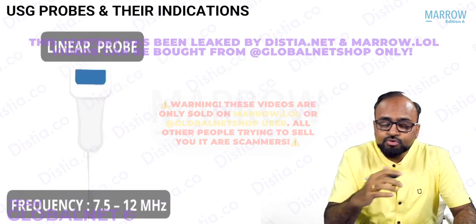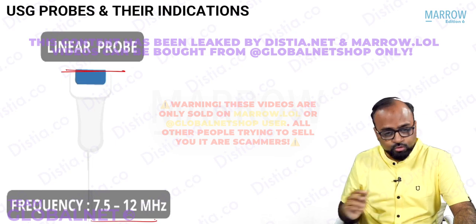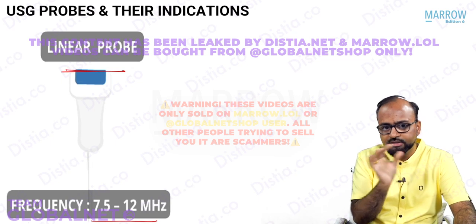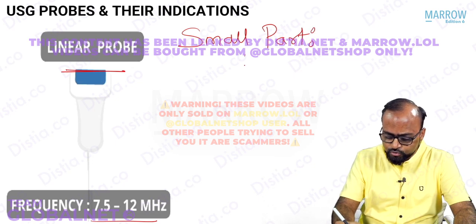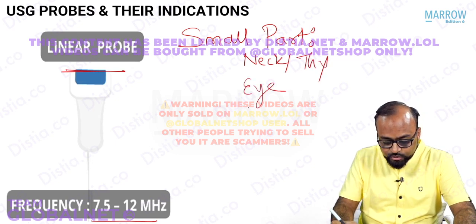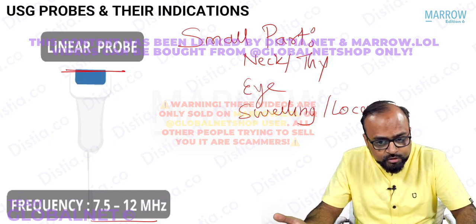The next probe which is used is called the linear probe because the surface of the probe is linear or flat like this. It has a slightly higher frequency, around 7.5 to 12 megahertz. And this probe is used for, just remember it this way, this is a small probe, linear probe. This is used for all the small part imaging. So it can be used for neck ultrasound, thyroid ultrasound, any small part, so eye ultrasound it is used, any swelling over the body anywhere of the local part, say the lipoma anywhere, right? This particular will be used.